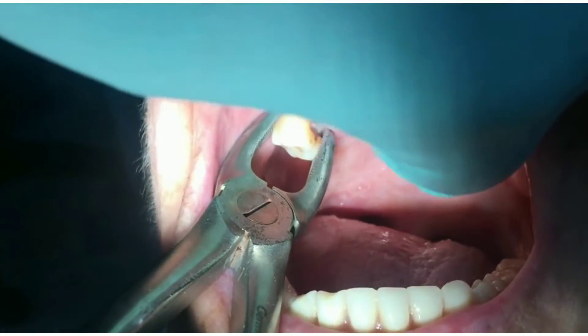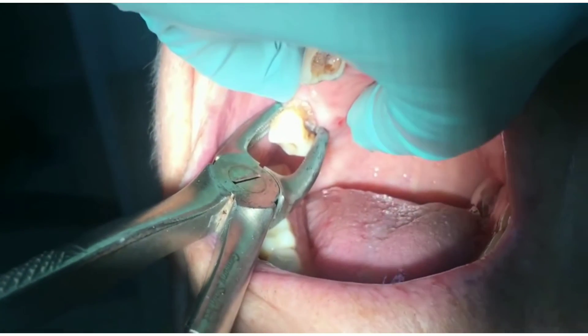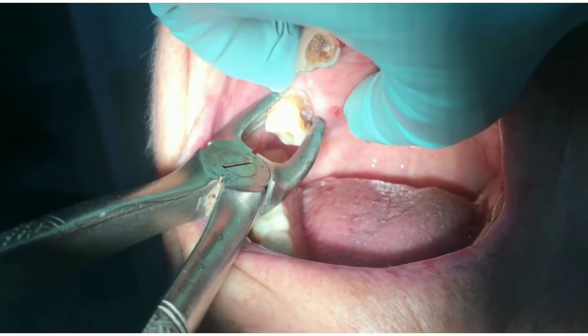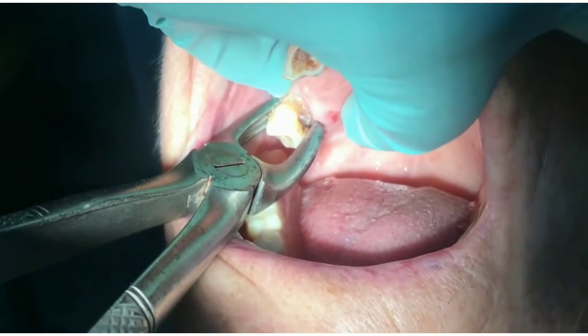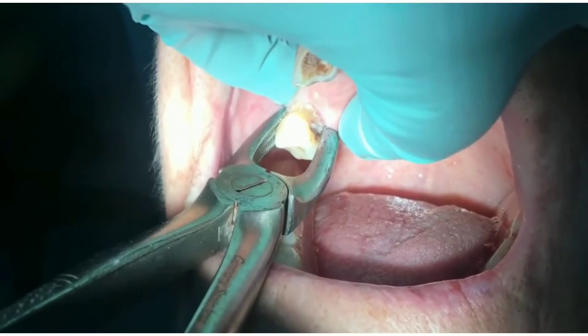Very often you start extracting a tooth and then you happen to luxate the adjacent tooth. I know it's such a panic moment, but hold on — in today's video we will learn the management of a luxated adjacent tooth during extraction.